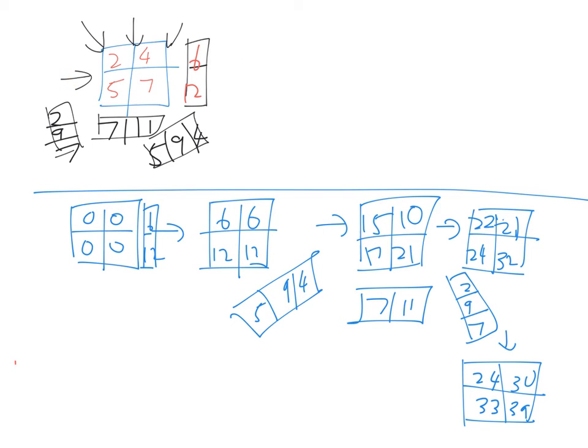So you're repeating. But you will notice the total of this 2 is how much? 18, right? This one? This one? This one? All 18, right? So you know why? Because these 2 total actually gives you the total of these 4. You try and see, add up these 4 numbers. 6 plus 12, isn't it 18? Because if you're doing this side, you add this 2, you add this 2, then you add this 2. That means you're adding this 4. So this is called the background intensity. That means the total in each box. So your total is 18.